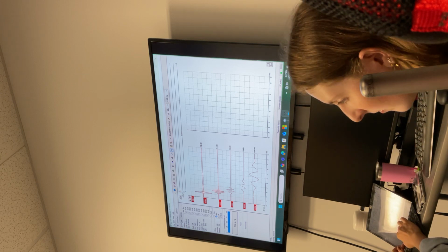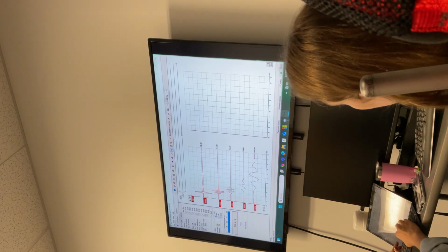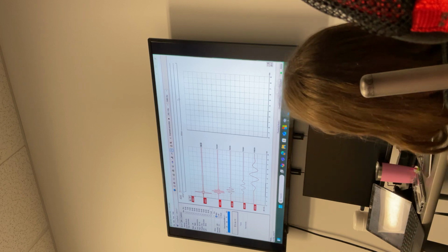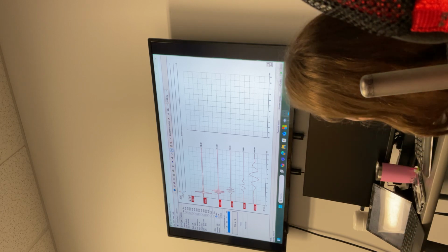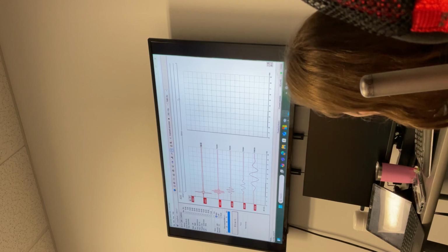I'm using this for educational purposes to see this. This is all the stimulus you are playing to the ear. There's no electrode in your ear or on your head. Anyway, we are not doing any recording. This is just the stimulus being played to the ear.